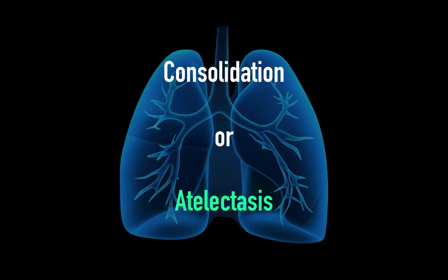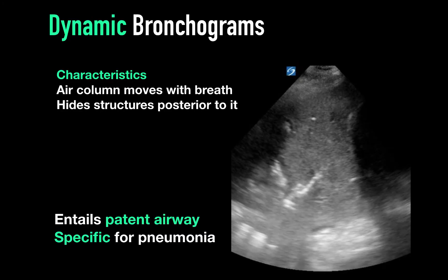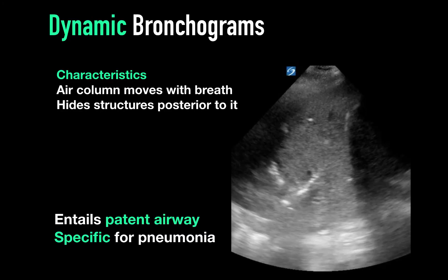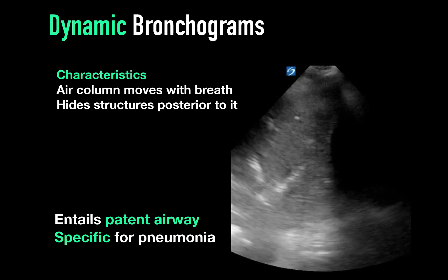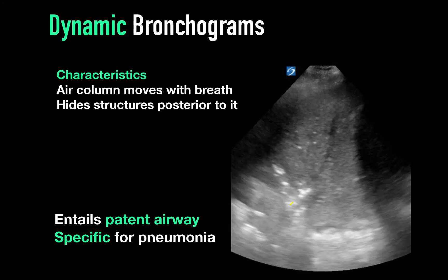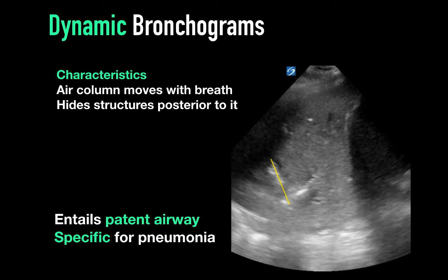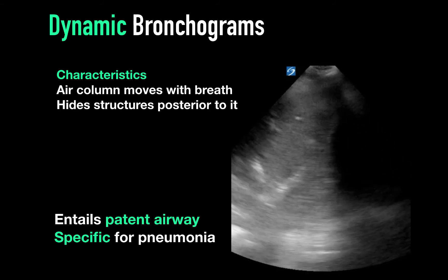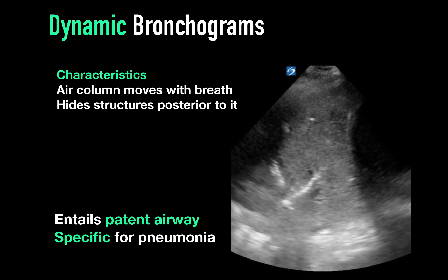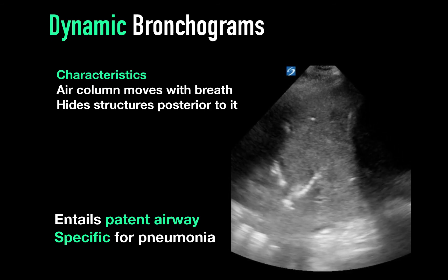It can be challenging to differentiate consolidation versus atelectasis. On an X-ray, we may see air bronchograms, and these can occasionally be displayed on ultrasound in select patients. In this example, we see very heavy consolidation and branching, scintillating, hyperechoic artifacts, which represent air-filled bronchioles. These are air columns that are moving with breathing, and this finding is highly specific for pneumonia or infective consolidation.